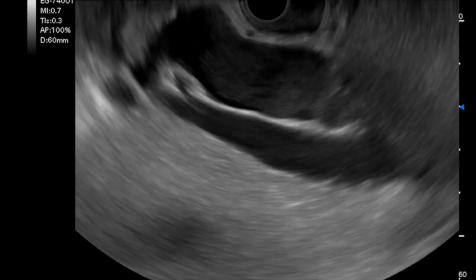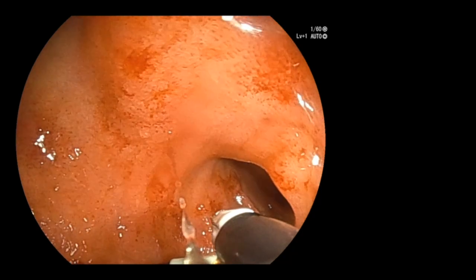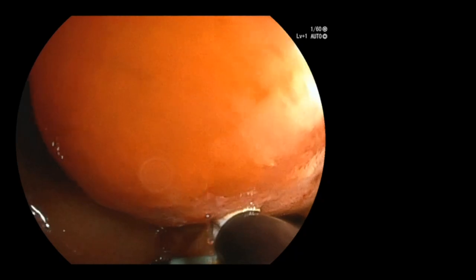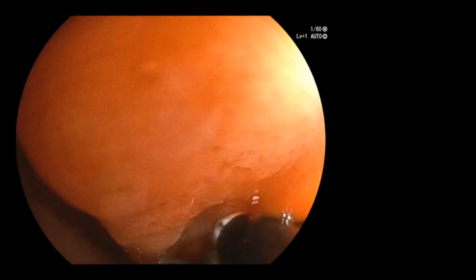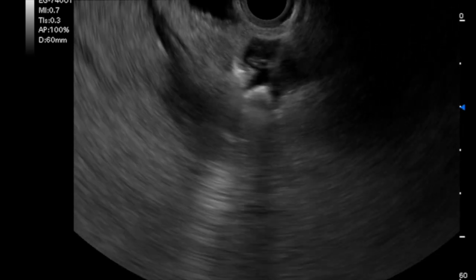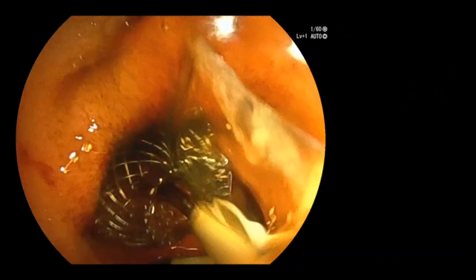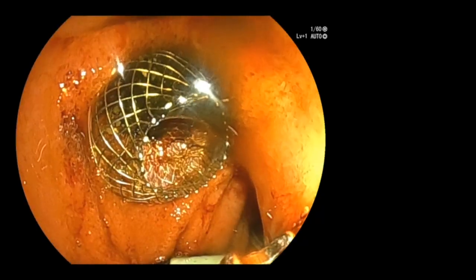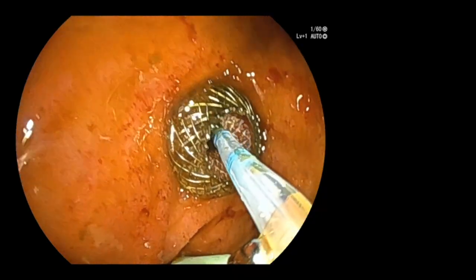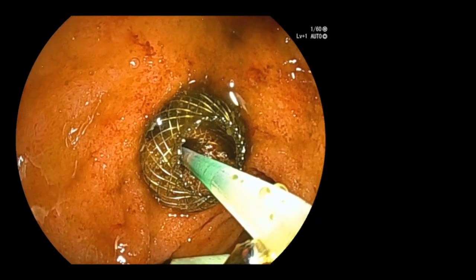Once an adequate window was identified at EUS for placement of the lumen-apposing metal stent, a corresponding optimal location was identified in the duodenal bulb on endoscopic view. Note that the uniquely positioned camera lens enables an unhindered forward endoscopic view. After puncturing the common bile duct and releasing the distal flange, the proximal flange was released on endoscopic view, and safe placement was confirmed by the rapid drainage of black bile. The unhindered view of the stent during deployment and post-deployment was appreciated. Using an ERCP cannula, a cholangiogram was obtained as one would using a standard gastroscope.